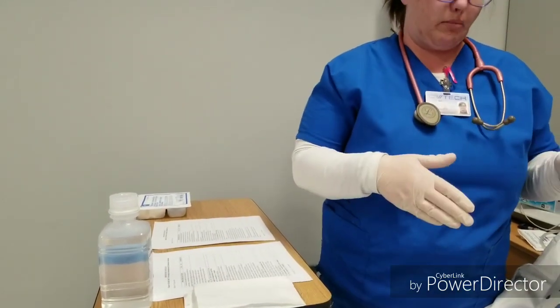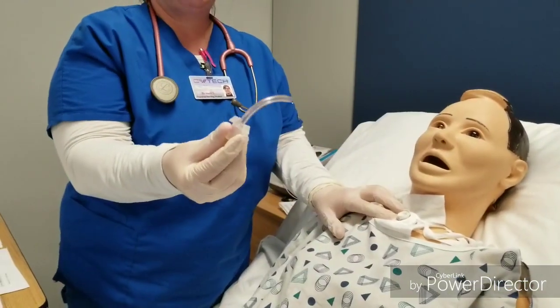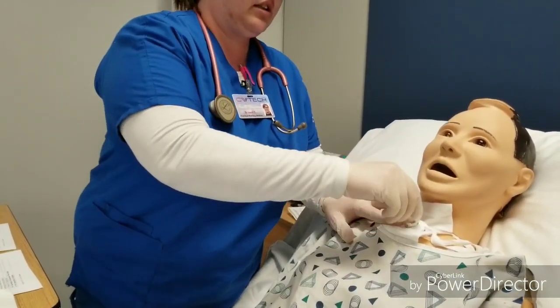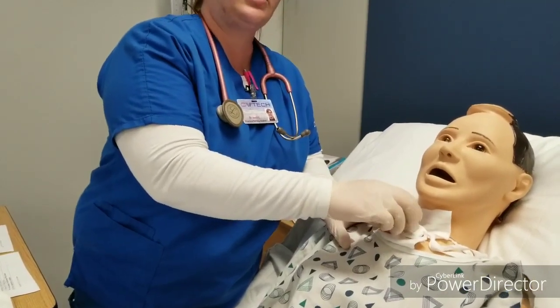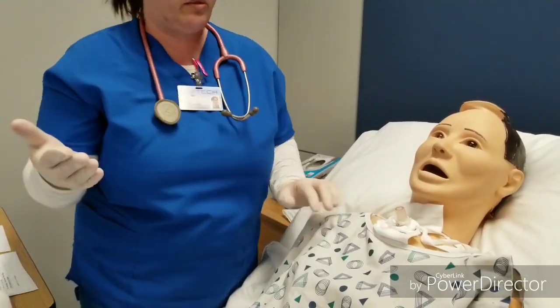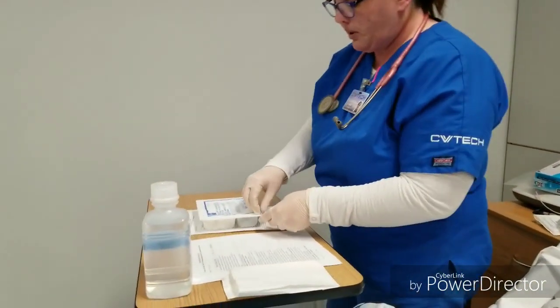Some trachs have disposable ones where you can just take them out, throw them away, apply a new one. Other trachs do not. They come out and you can clean them. This is what we'll be cleaning. I'm going to put that back in, and it locks on so when the patient coughs it can't just fly out. Alright, I'm going to open this up.